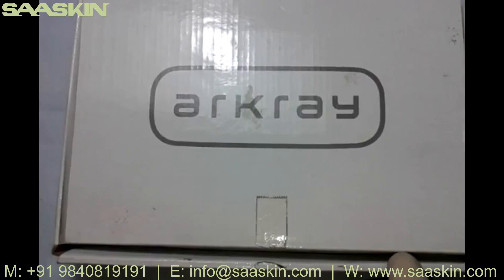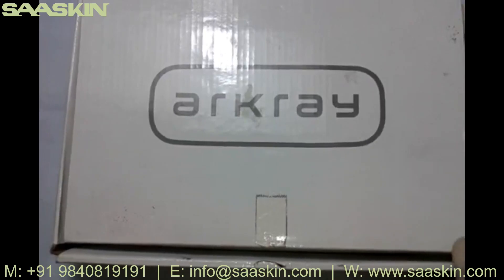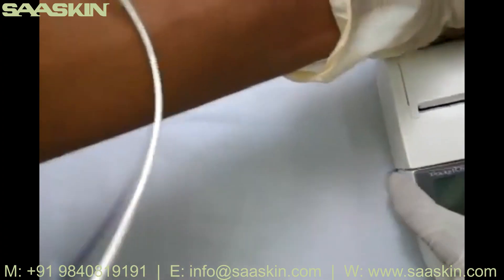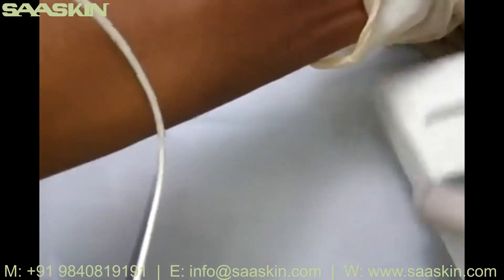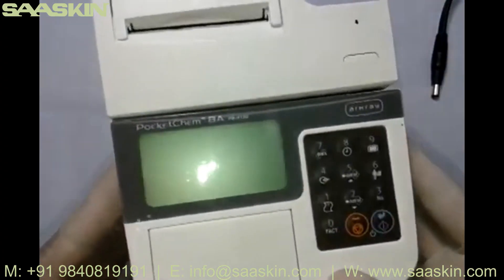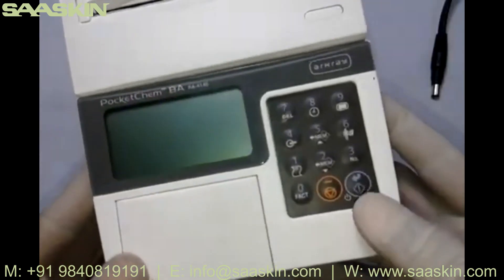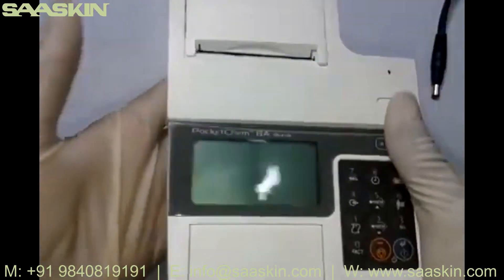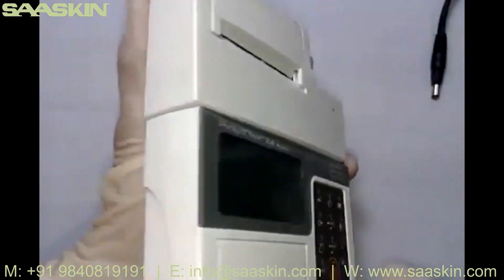Today I'm going to show you how to perform a blood ammonia test with Arcray's latest instrument called Pocket Chem BA. I'll quickly go through the instrument. This is the instrument from Arcray Japan — it has a simple keypad, easy to operate, and it's very small, compact, lightweight, and portable.